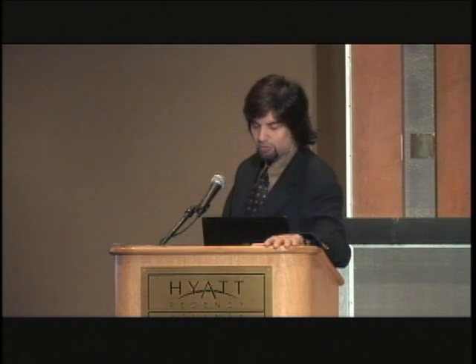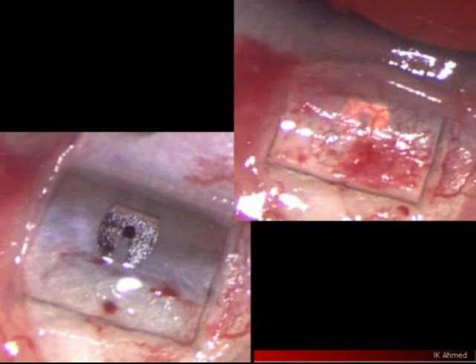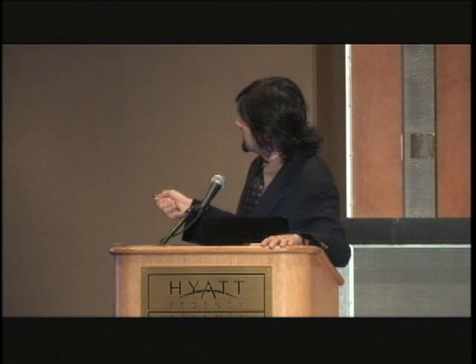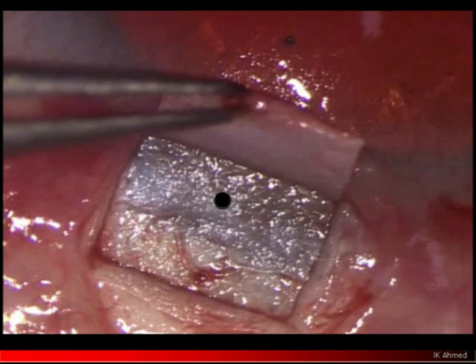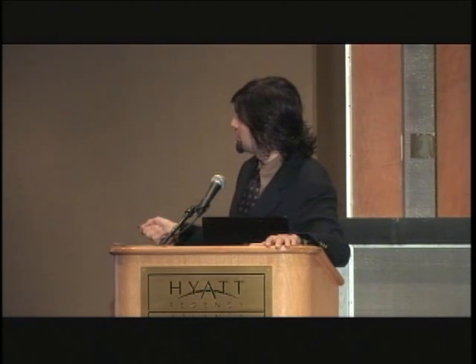A little bit of a gap between the apex of the flap and the anterior aspect of the implant will help prevent compression of the implant by the flap. Since I've identified that point, I can now measure out exactly what I want the dimensions to be — about four by three millimeters is my preference. Here's an example of placement exactly at the anterior aspect of the spur with nice coverage all the way around the implant and a little bit anterior to it as well.